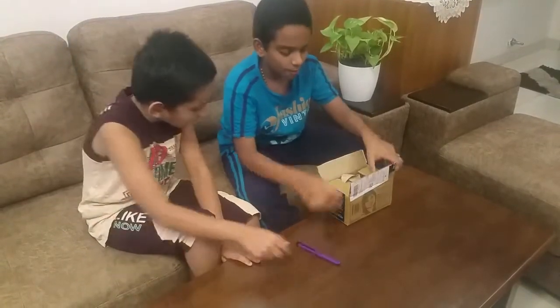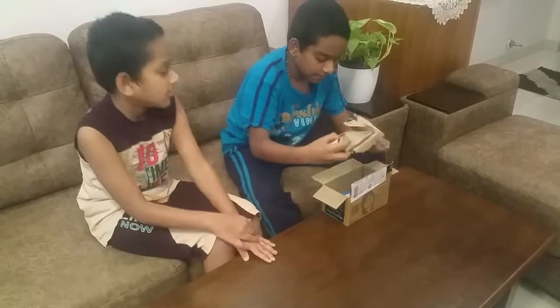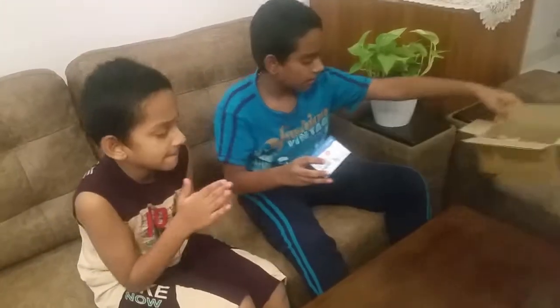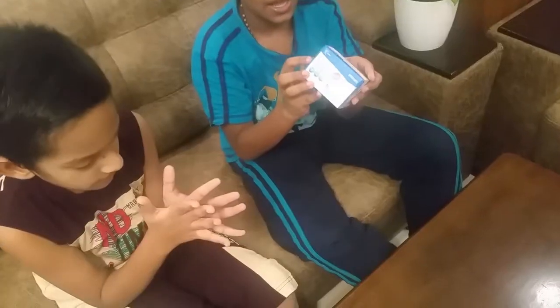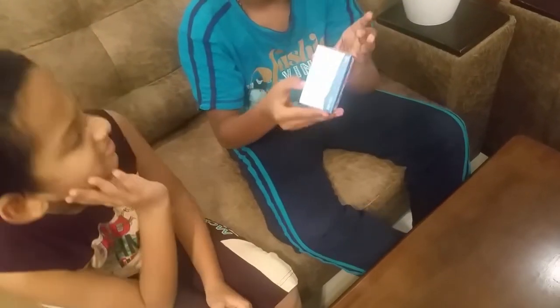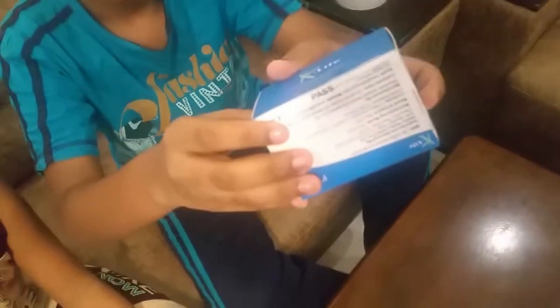So guys, we have opened it. We have a bunch of papers and we have a pulse oximeter here. Bye bye box! This is from K-Life, so thank you K-Life for giving us this product. Now let's open it — we have a seal here.